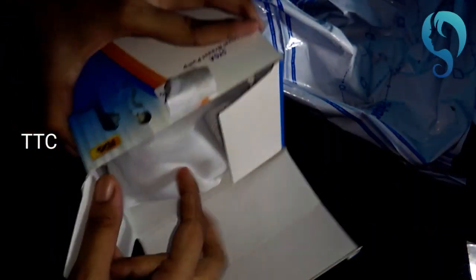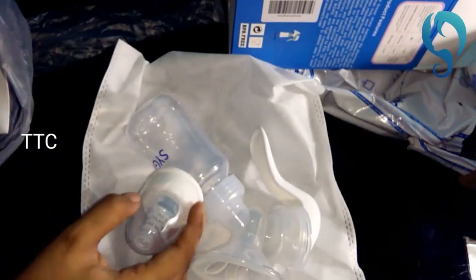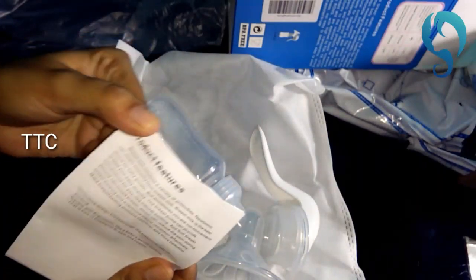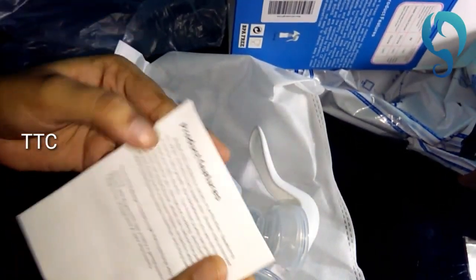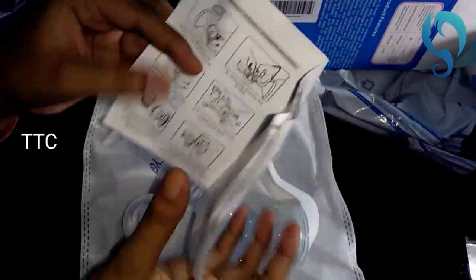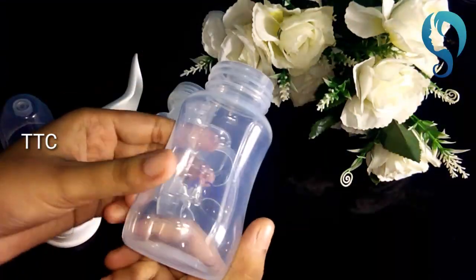You can check if the packaging has any damage. Inside the box, you can find the pumping machine with a cap and nipple. There are also instructions explaining how it is used, and a warranty card providing 1 year warranty.